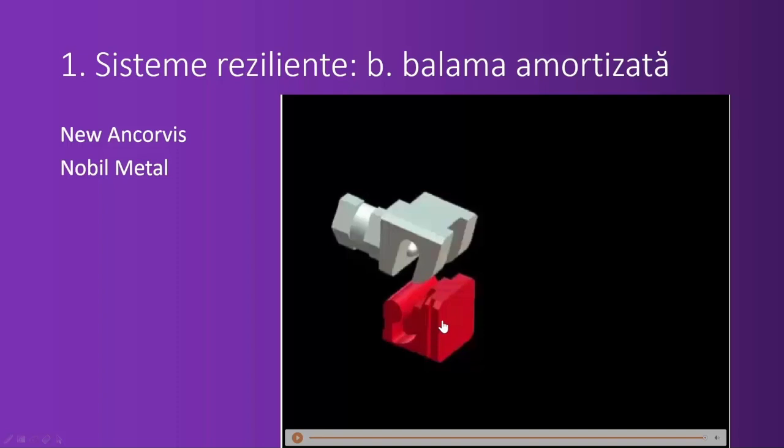This was made by the company in metal, and it was an overcasting of this metal part with the wax pattern that would be the covering of the remaining teeth. We will see in detail how we were doing it.